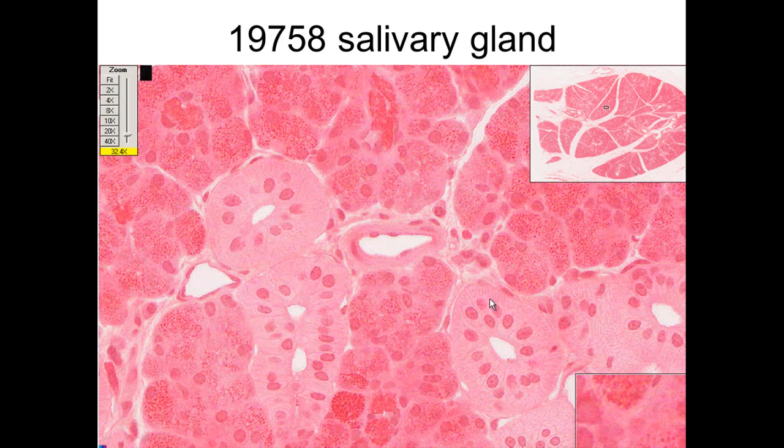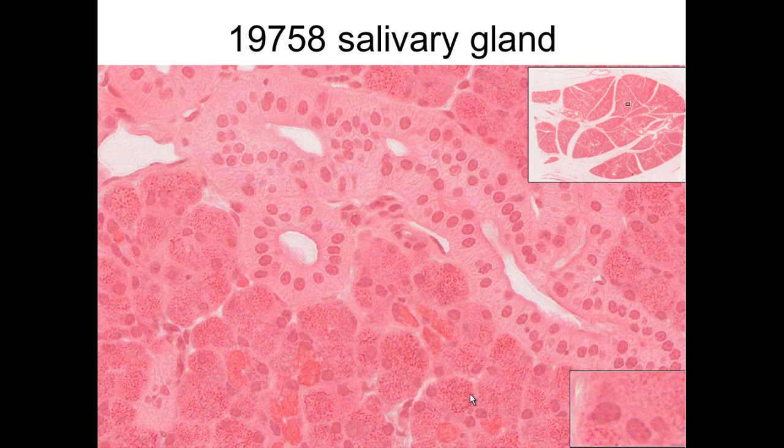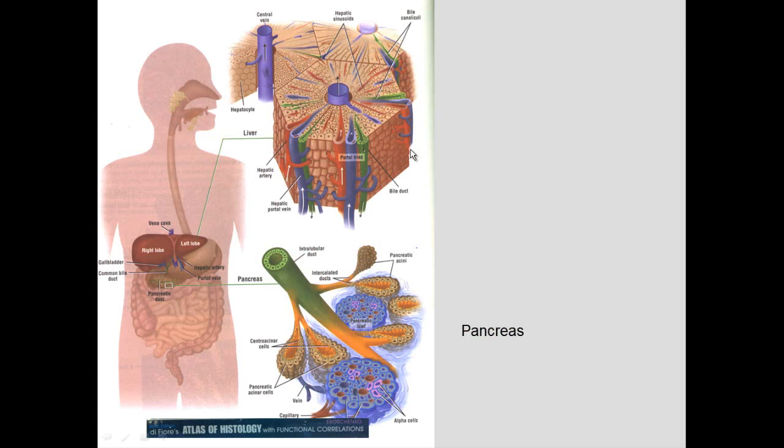Here again we can see another salivary gland. These are the serous type, in which the cells are more spherical in shape and the nucleus is not at the base, and then we see the striated ducts. You can see striations very nicely here, which are the mitochondria lined up. As I mentioned to you again, you can see the many striations that we have there.